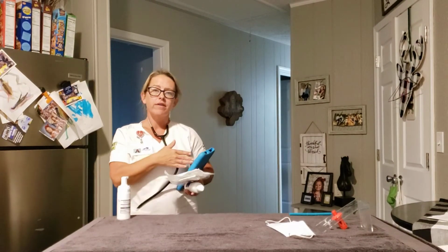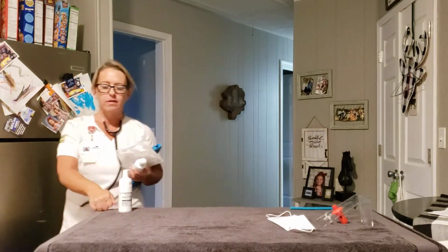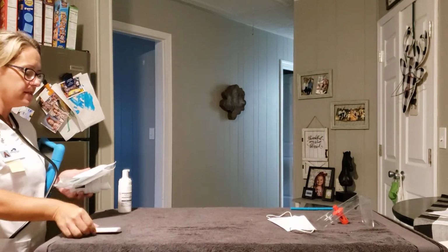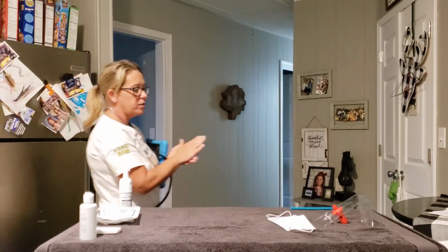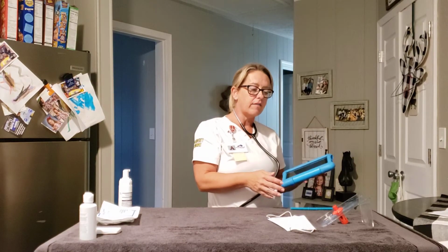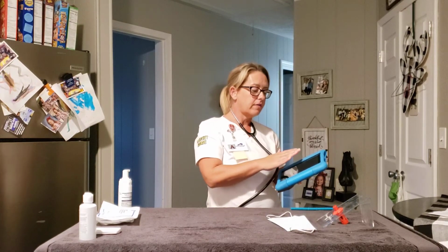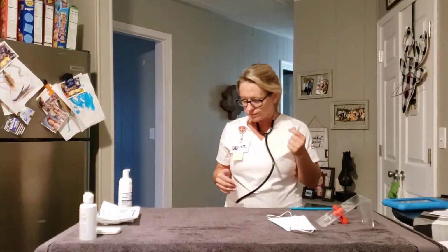Okay, I have verified the doctor's orders and I have gathered my supplies. Hello, my name is Frances. I'm going to be your student nurse today. Wash my hands. Can you please tell me your name, date of birth, and if you're allergic to anything? And I have compared it to the MAR and the hospital bracelet, and they all match up.